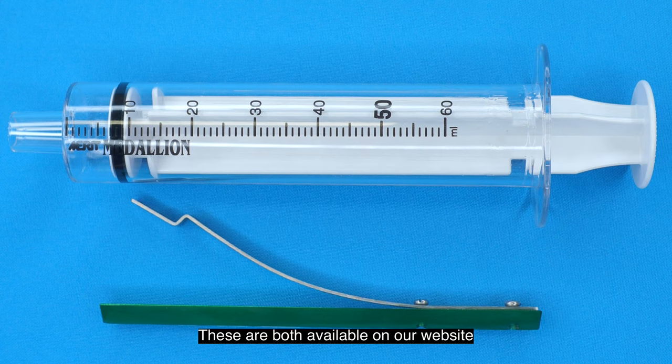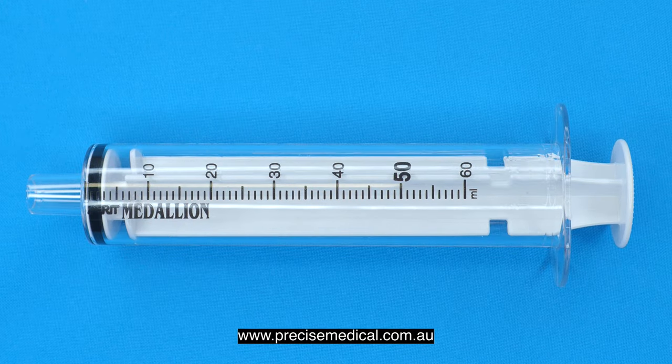These are both available on our website, precisemedical.com.au.